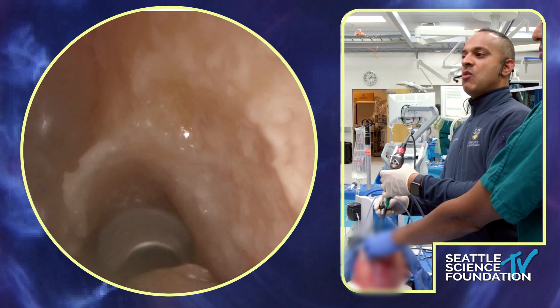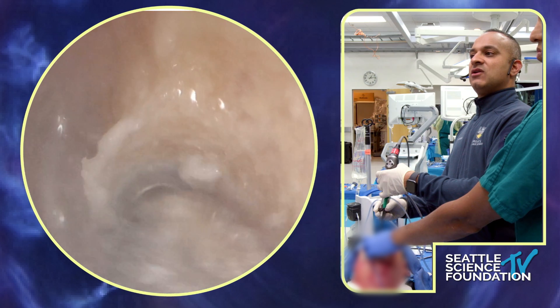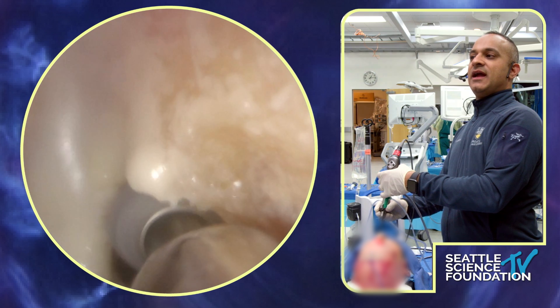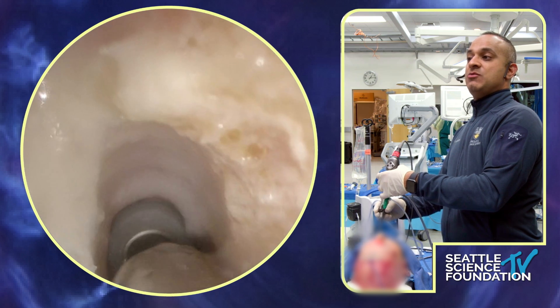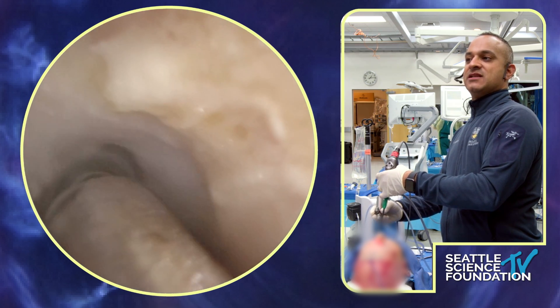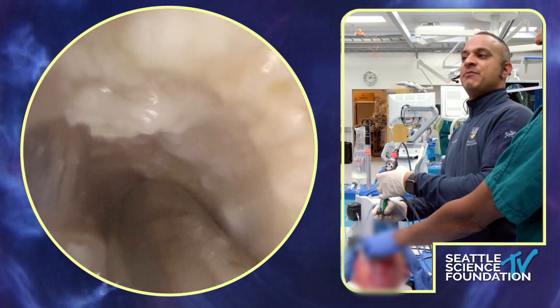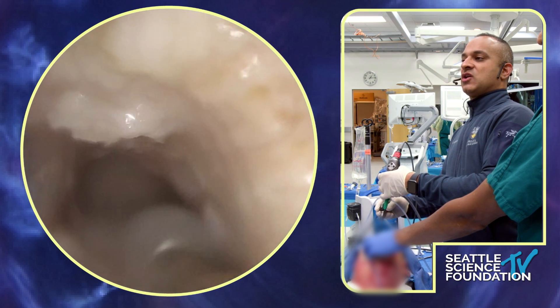You can come more anterior but you can't go more lateral than what he just showed me — I can see it blotting right there. Now all I'm going to do is use that as my lateral landmark and drive myself anteromedially, knowing where the first olfactory neuron is so I never go medial there — I go anterior and then medial to create that half-horseshoe shape. This is a drill-out 2B; Nitin talked about a hand-tool 2B but this is a drill-out 2B. I haven't taken down the septum yet but I've still created a maximal aperture into the frontal sinus. You could see some blue — that indicates you've come to the inter-sinus septum, so as I keep going I'm going to cross over and be past midline.